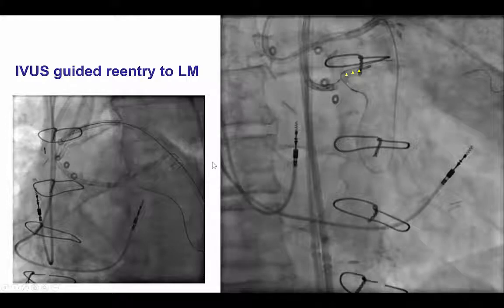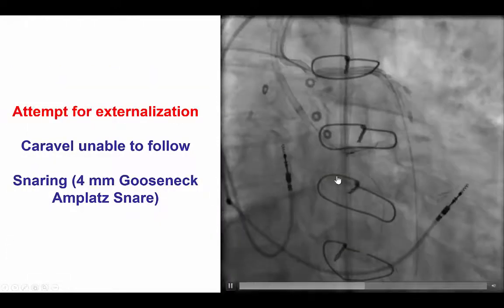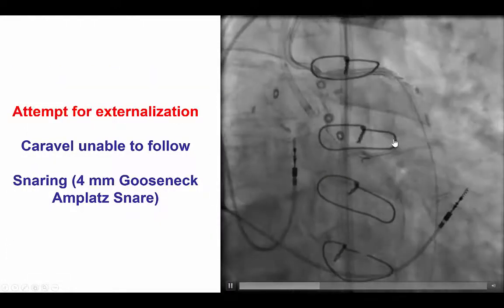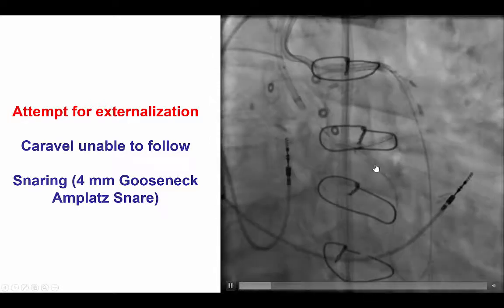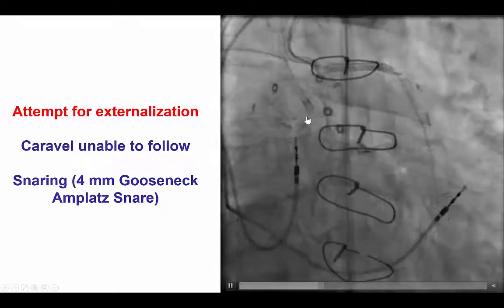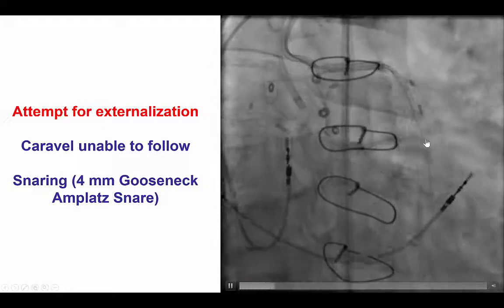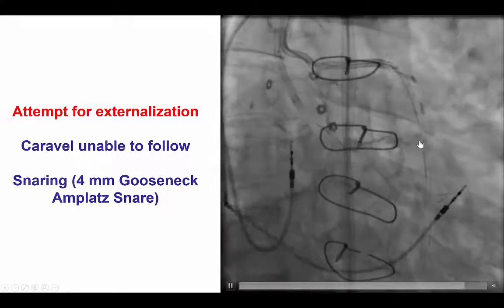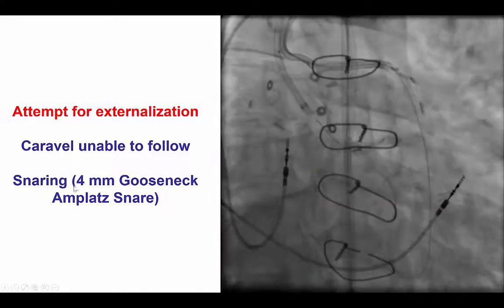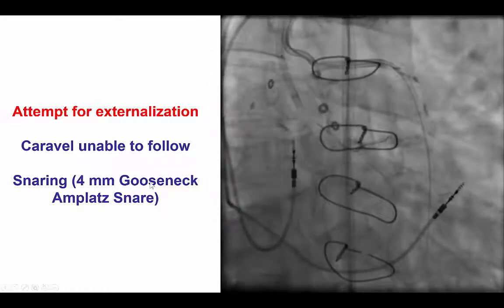We then tried to perform a stent reverse CART by advancing a retrograde guidewire into the LAD and the left main. We used intravascular ultrasound guidance to ensure that the wire was in the true lumen. The wire did cross into the true lumen, but unfortunately instead of going towards the left main and the aorta, the wire was going towards the mid and distal LAD. That is why we used a 4 mm gooseneck snare to snare the guidewire.